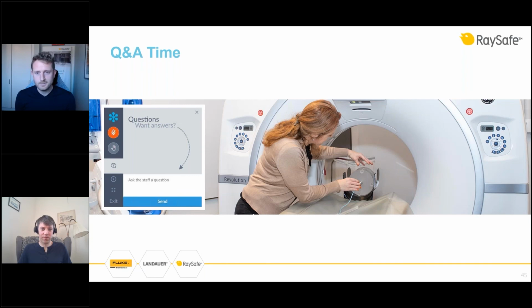How can the X2 measure kV on a CT machine? Should I take it, Matthias, or would you like? You go, Patrick. I also have an RF sensor here. We cannot measure kV with the ion chamber, since it will only give you dose rates, DLP, and time.